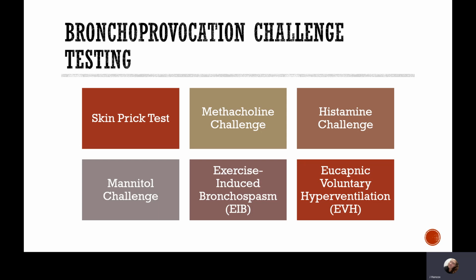So how it will work is that we will do an ECG and a flow loop as a baseline, and the patient will remain on the ECG, and then they will be asked to run on a treadmill or cycle on a cycle ergometer or a bicycle, basically, for a certain amount of time until they reach their maximum heart rate, which we will calculate using an equation. After they reach their maximum heart rate, they will then be taken off exercise and asked to sit down.